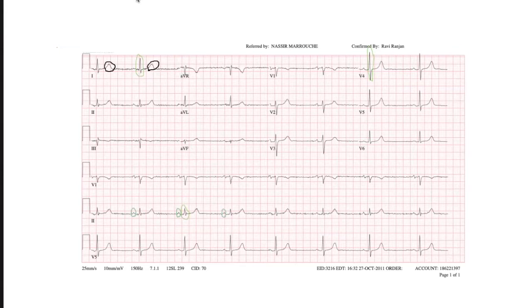So does it look like it consistently goes P, QRST, P, QRST, or does it look like it maybe changes rhythm throughout? What do you think, Ben? I think it looks pretty consistent. Great. So if we have a slow heart rate and a normal rhythm, what disease do you think we would call it?